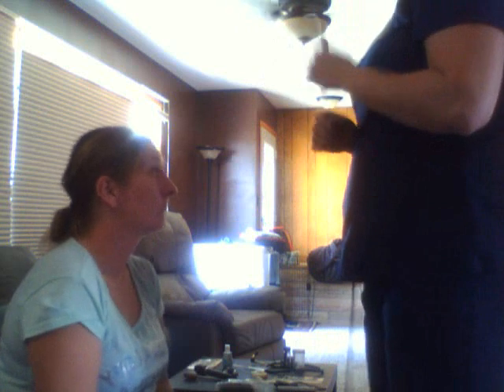And now I'm going to do the whisper test. Repeat what I say. Hi, John. Okay, that worked. I'm going to do the Weber test. So this test is conducted by, I'm going to hit it. There's going to be vibration. I need you to tell me when you no longer hear it.